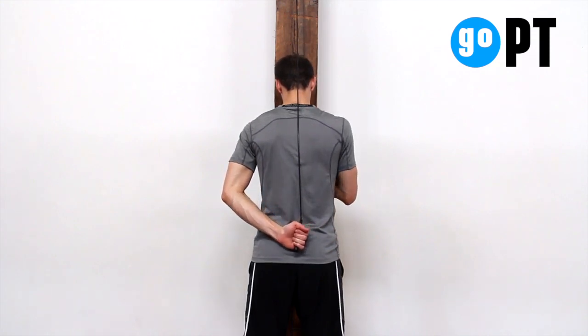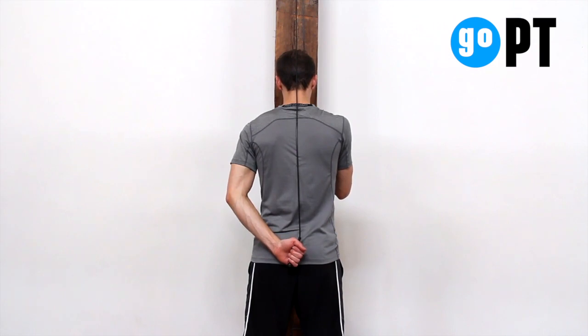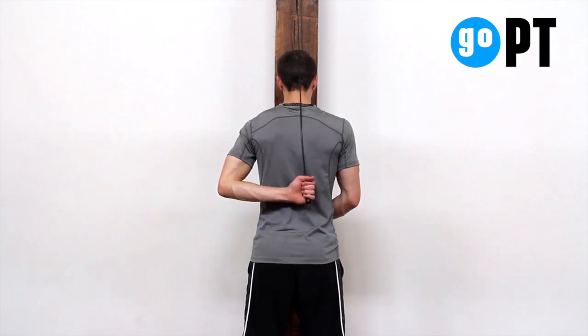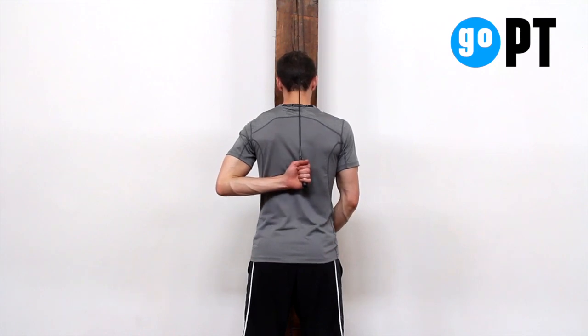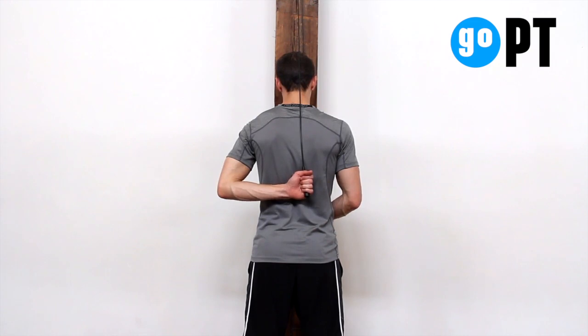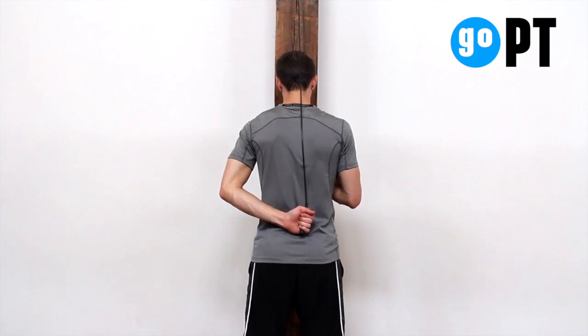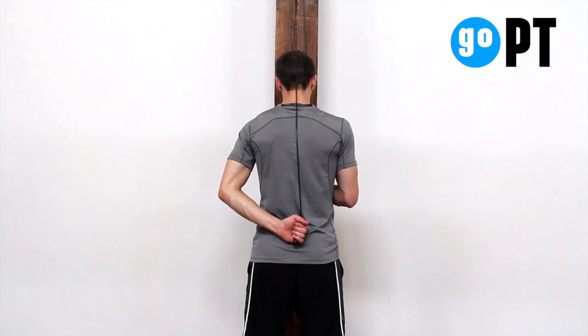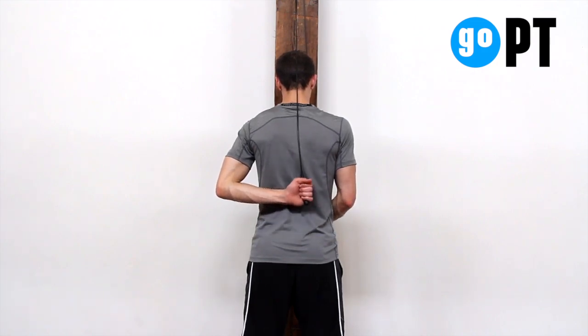Pull down on the pulley in front of you, moving your affected arm up the middle of your back toward your shoulder blades until you feel a stretch or can no longer progress further. Be sure to use your unaffected arm for the majority of the movement while your affected arm has little contribution. Pause and then slowly lower.